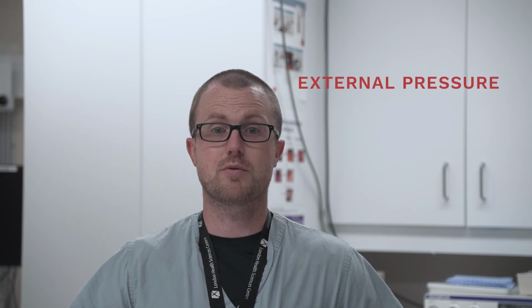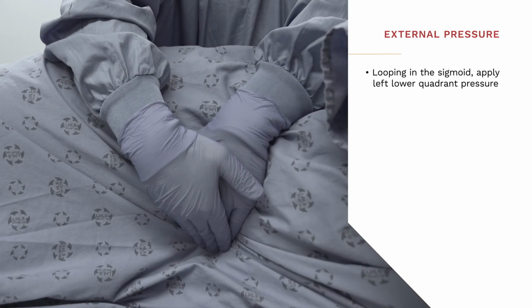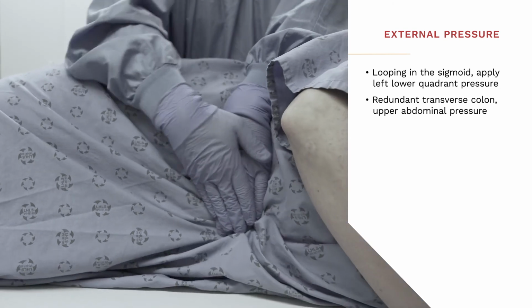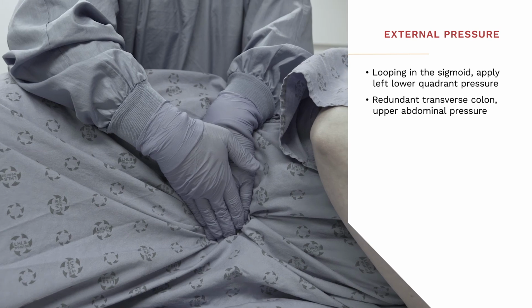External pressure can be provided in two main forms. The first and most common is abdominal pressure provided by the hand of a nurse or assistant. The ScopeGuide can be particularly useful here to guide where pressure will be highest yield. If looping is in the sigmoid, left lower quadrant pressure is ideal. In the case of a redundant transverse colon, upper abdominal pressure during scope advancement can help prevent the colon from dipping into the pelvis. Positioning the patient prone also allows external pressure from the bed.